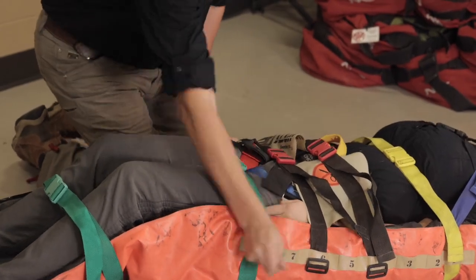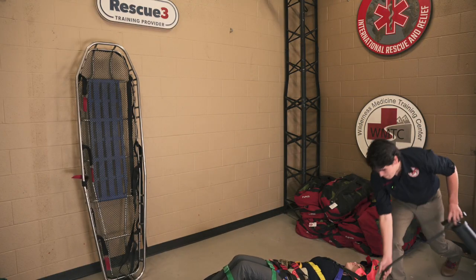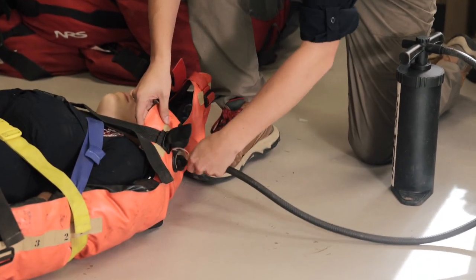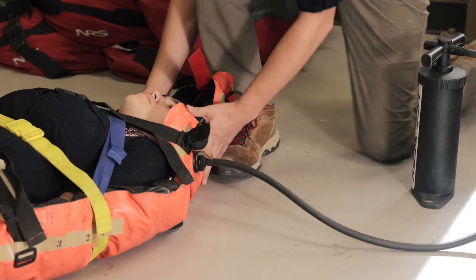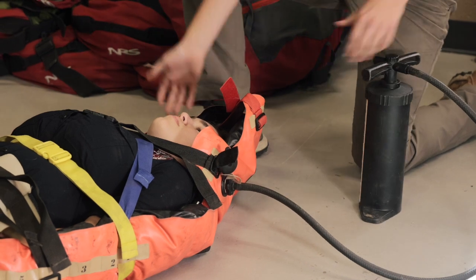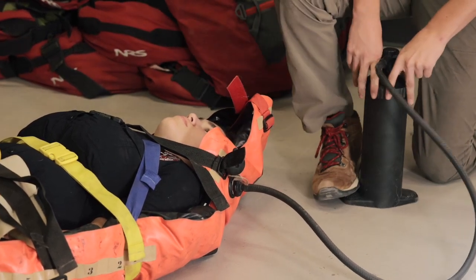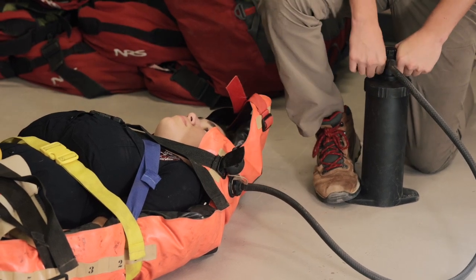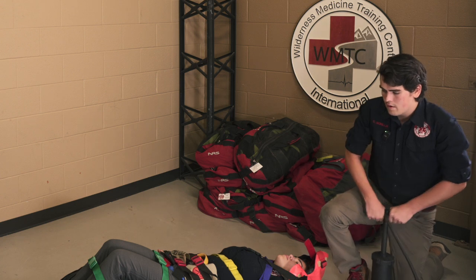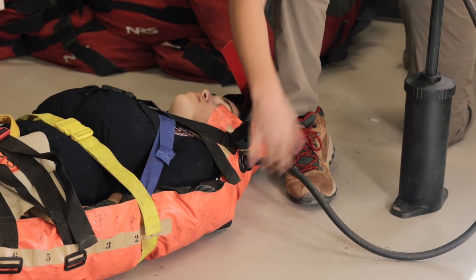Once you're done with that, the next step is to pull the air out of the vac mat and solidify it as a backboard for the patient. At this point, have an assistant help hold the legs up and hold it around the patient's head if necessary. Take the pump and pull the air out of the vac mat. This works best with nice, slow, even pulls. And just like that, you've got a nice backboard for your patient.